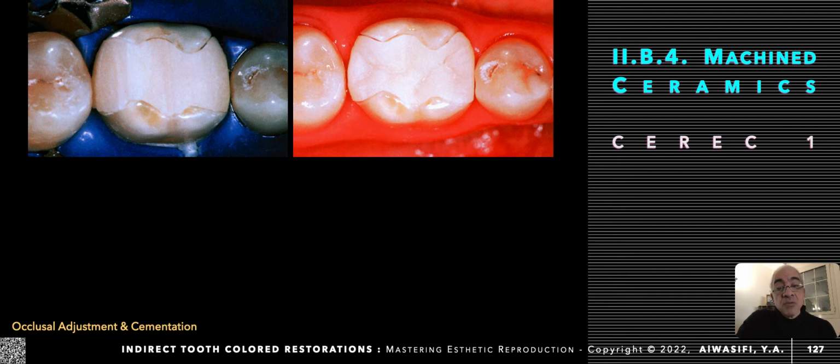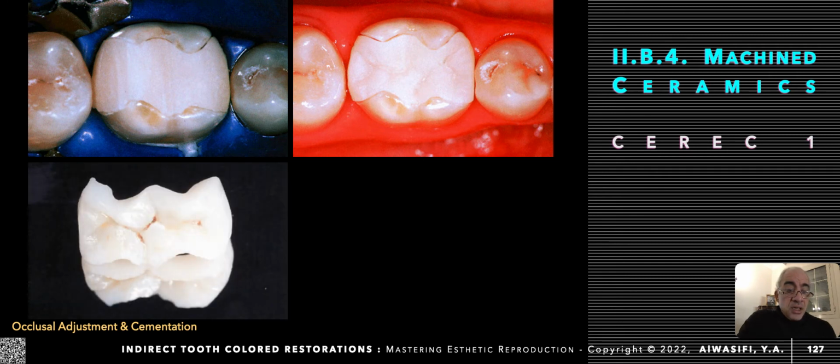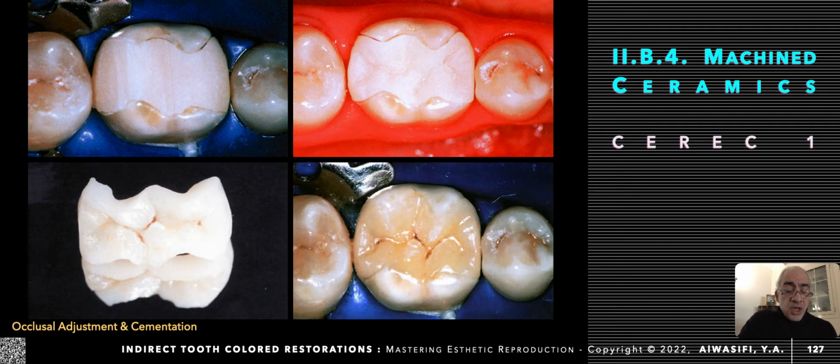That's why at this time it was not popular, and it was also a highly expensive, high cost procedure, okay, and it was non-profitable as assumed for the new devices. Then your workpiece is also color corrected by adding low fusing feldspathic porcelain, and this is after cementation. You could note the marginal integrity is not satisfactory as expected.